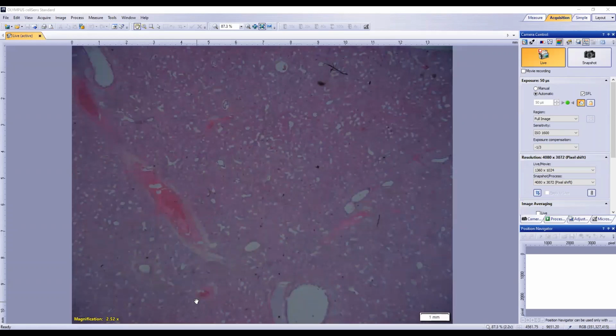In many cases, we see a lot of macrophages infiltrate with many of the disease processes, and also metaplasia happens in the epithelium. So these layers should be considered. And then we look for surrounding tissue of the bronchi and bronchioles. Look for nodular hyperplasia of lymphocytes, if there is any, or is there any specific pattern.